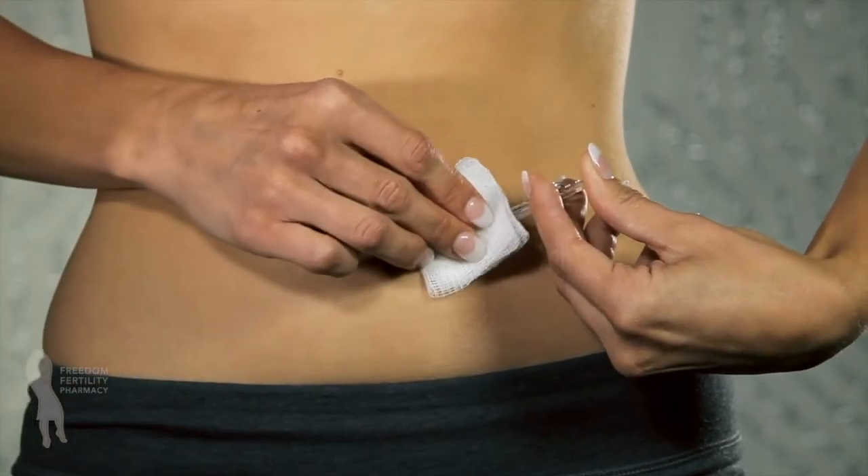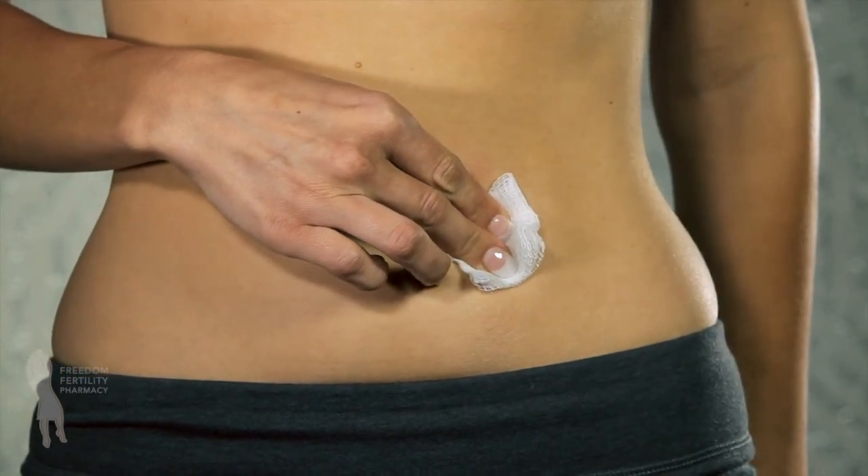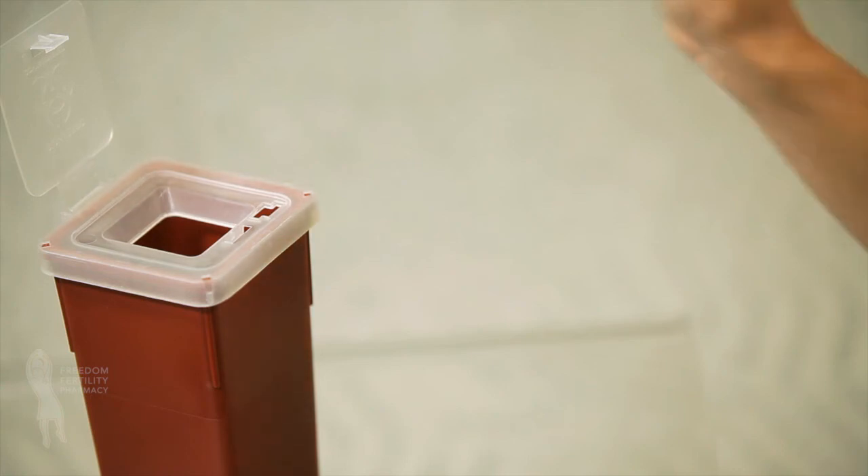Gently withdraw the needle and apply pressure to the injection site with a sterile gauze pad. Once your injection is complete, dispose of the used needle and syringe in your safety container.